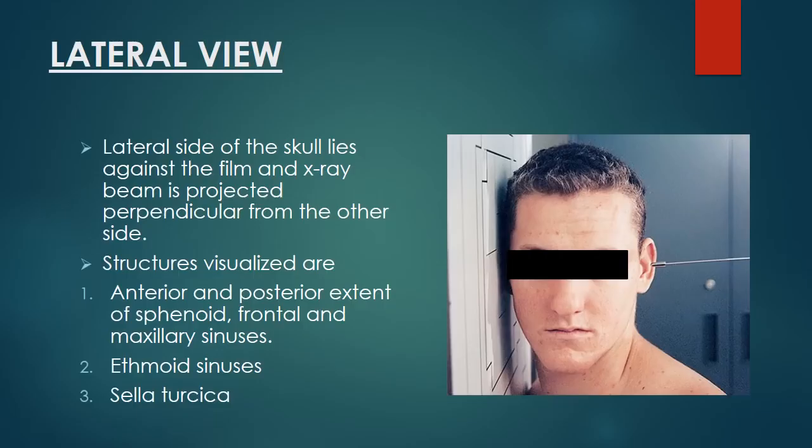Other view is lateral view. Here the lateral side of the skull lies against the film and the X-ray beam is projected perpendicular from the other side. The structures visualized are the anterior and posterior extent of the sphenoid, frontal and maxillary sinuses, ethmoid sinuses and sella turcica.